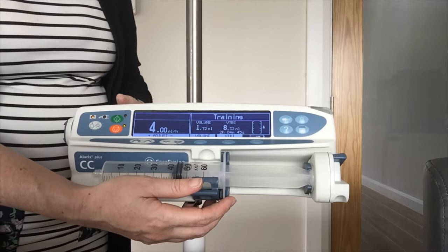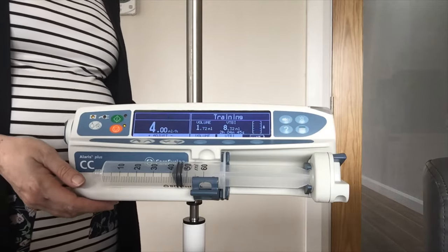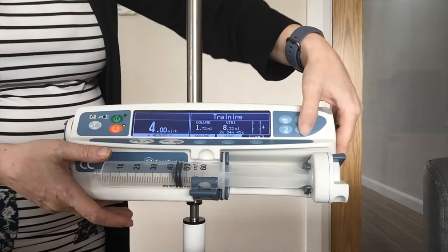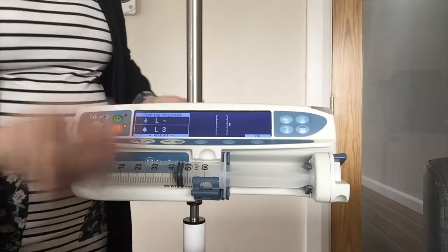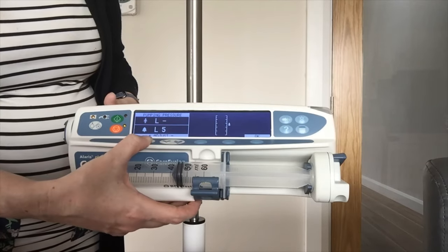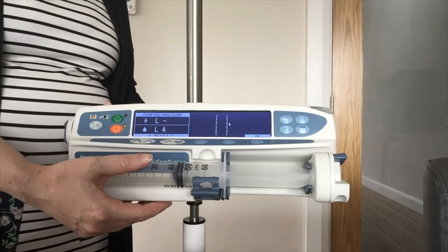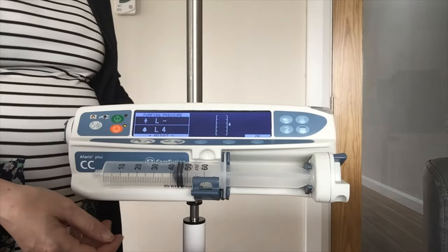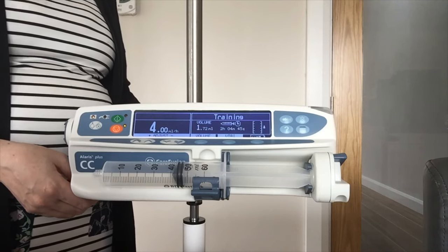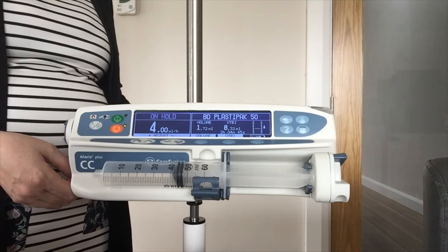The last key is for your pressure levels. The pressure levels are defaulted — your alarm level is at level 4, which is your typical adult level. If that needs adjusting, go to your pressure level button and use your arrows up and down to adjust. Be aware: the higher you go the less sensitive it will be to an occlusion; the lower you go the more sensitive it will be to an occlusion in the line. If you do get an occlusion, the pump has a back-off so it will go into a reverse pumping action — so if there was a kink in the line and you released it, there won't be a buildup of drug to give a post-occlusion bolus to the patient.